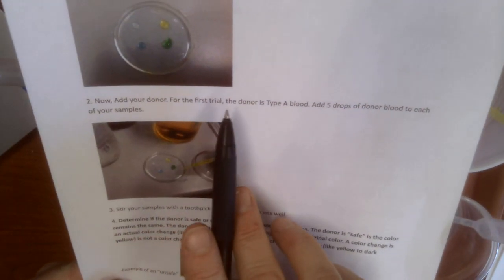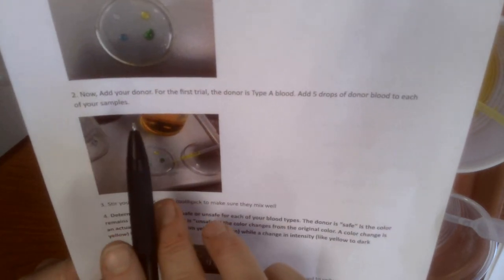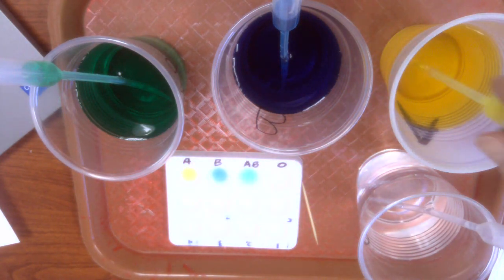So the next step says add your donor. For the first trial, the donor is type A. Add 5 drops of donor blood to each of your samples. Yes, even type A itself.